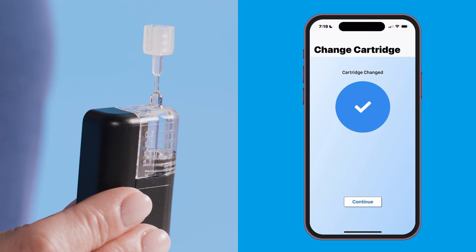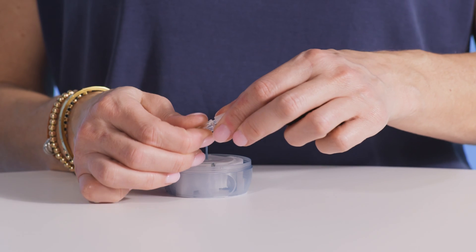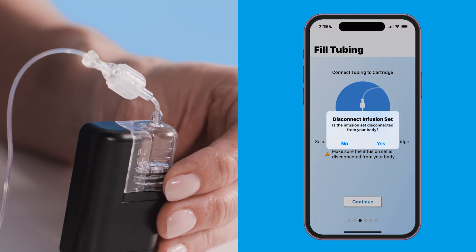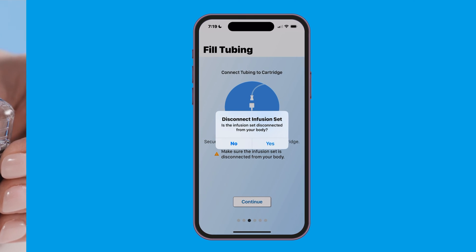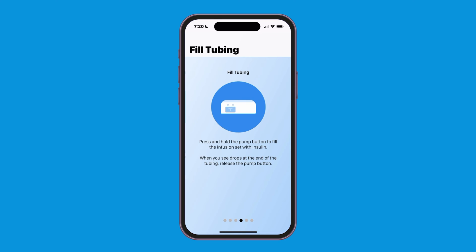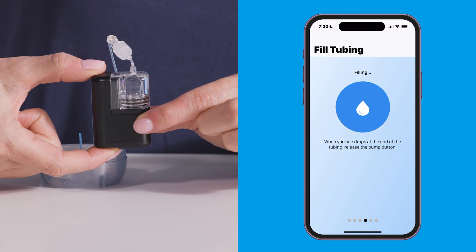Next, you'll fill the tube. Again, confirm that the infusion set is disconnected from your body. Attach tubing from a new infusion set to the T-lock connector on the cartridge, then tap continue. Hold the pump with the T-lock connector facing up — this will make sure any air in the cartridge will be pushed through the tubing first. Then tap yes on the mobile app.